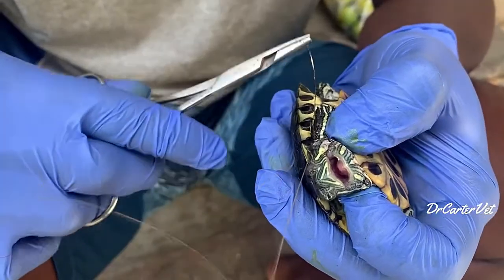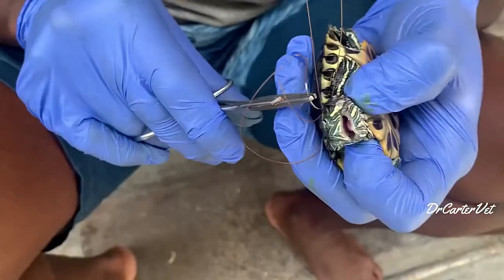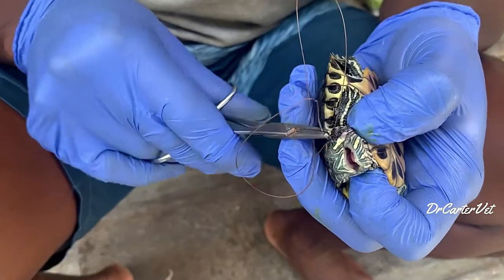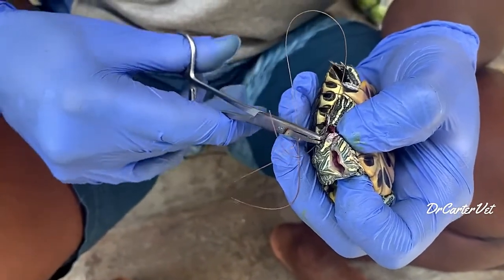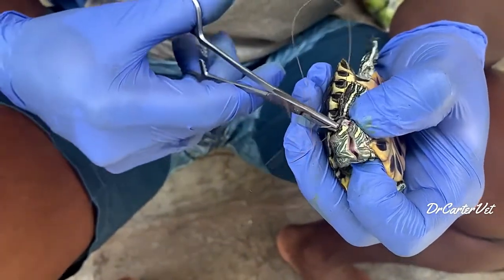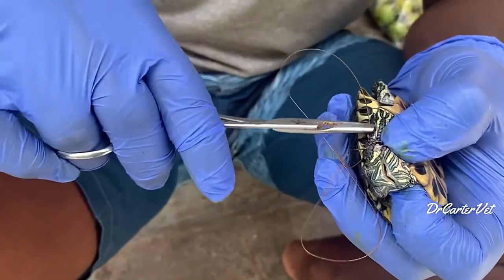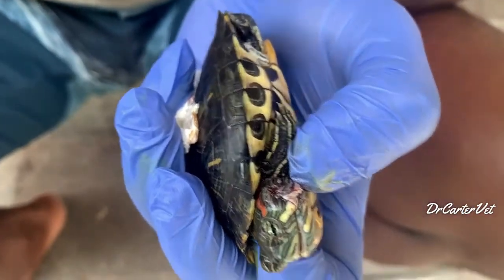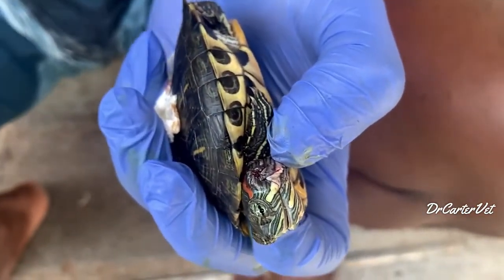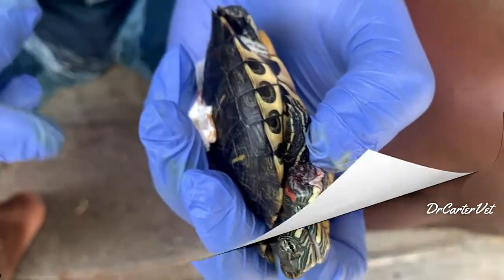Some people may leave it open to heal by what's called second intention. Based on the situation, the owner compliance, and the housing facility the turtle is in, you can make that choice yourself. If you're going to leave it open, though, I'd recommend treating it with a topical antiseptic on a daily basis and putting the turtle on what's called a dry dock. But this one wasn't going on a dry dock, so I sutured it.